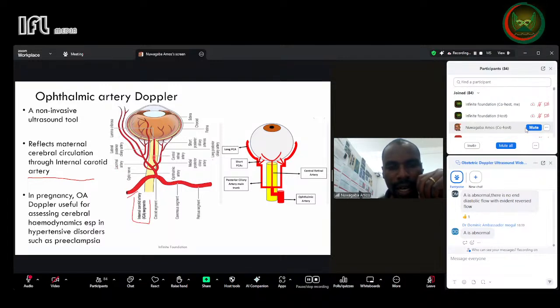And in terms of anatomy, you see it. This is the optic nerve, and after coming off the internal carotid artery, it crosses medially and then crosses to the lateral side, where it gives off even more branches that go and perfuse the organ.